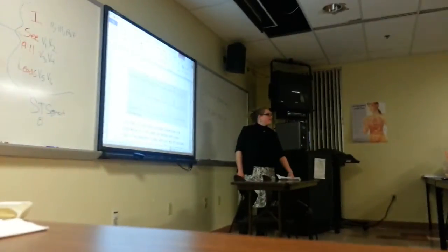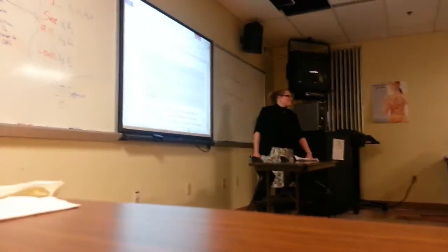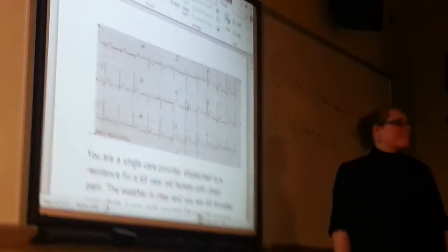It looks like it goes farther down. It's more negative, right? It's more below the isoelectric line than it is above. Does that make sense? Boom.